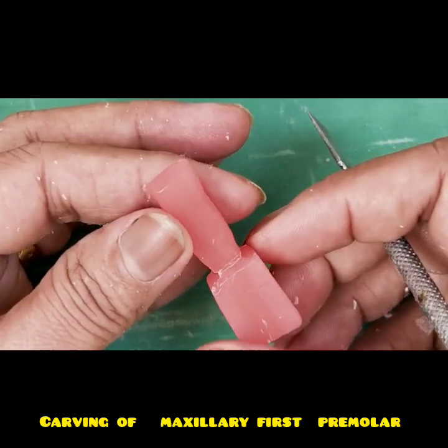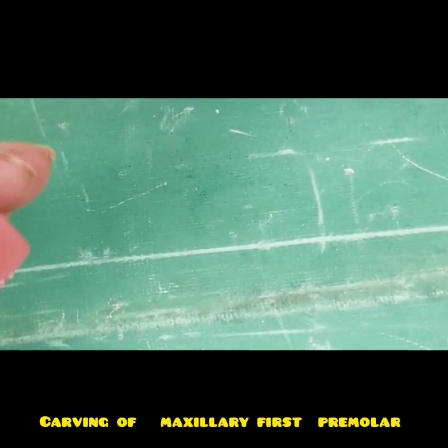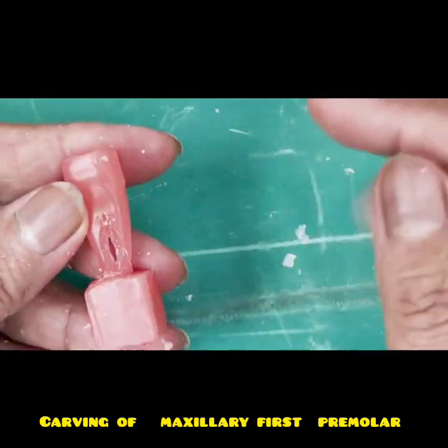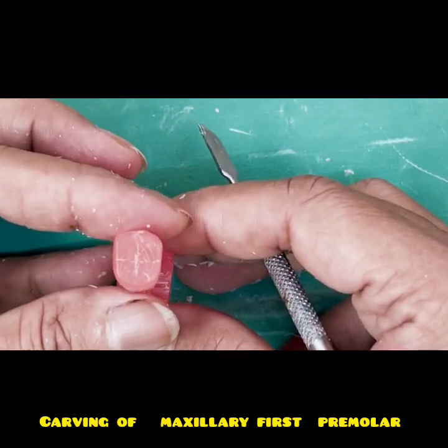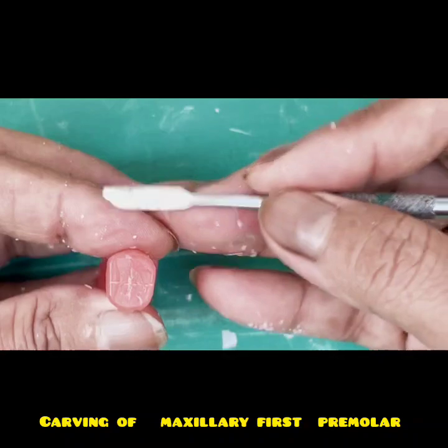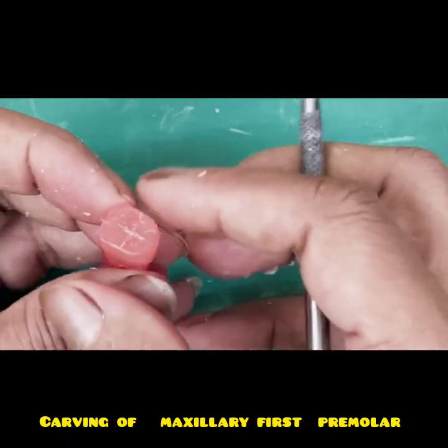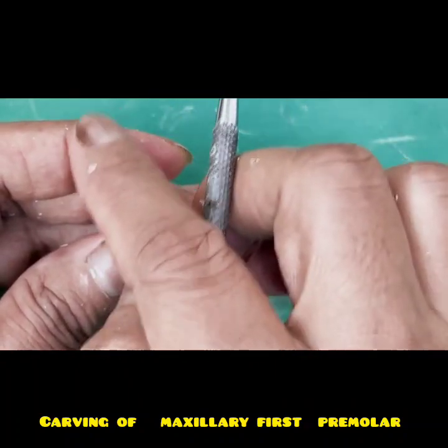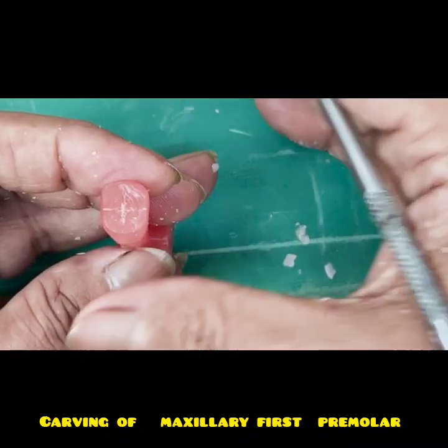You all must have done maxillary first premolar carving and submitted also. So now I will tell you the tricks and tips of maxillary first premolar carving. I have already made roughly the crown and the two roots. So let us concentrate on the occlusal surface. Briefly, it has a buccal surface which resembles the canine, and both the proximal surfaces converge towards the lingual and form a nice U-shape contour if you see from the occlusal surface, and the crown is elongated buccolingually.